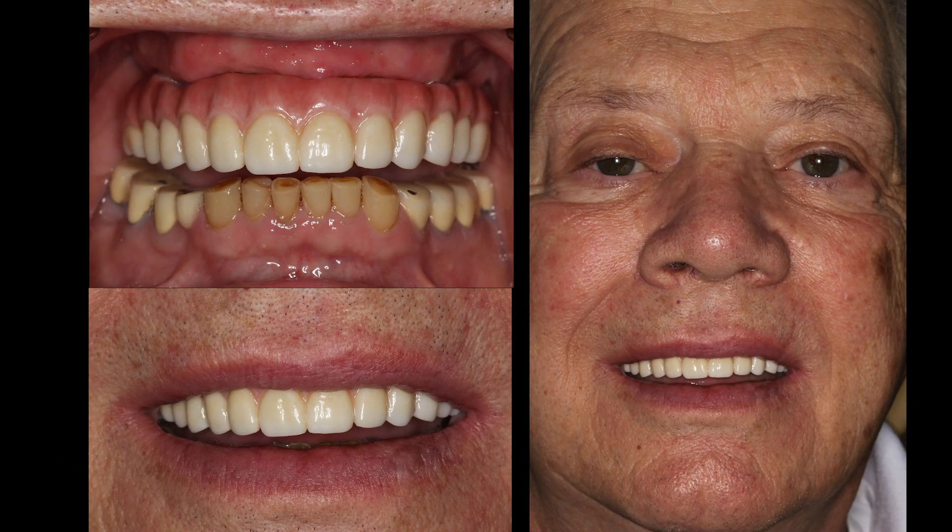In conclusion, for many years the best implant option for the fully edentulous patient has been the fixed acrylic hybrid denture. Although these appliances have served patients well and have been nothing short of life-changing, they have also been subject to wear, chipping, breakage, and debonding of the denture teeth. Recent technological innovations have brought about the Bruxer full-arch implant prosthesis, which pairs the optimal function of the traditional hybrid with the superior strength of monolithic zirconia. As patients respond to the newest and best implant dentistry has to offer, the ability to create restorations that are at once aesthetic and durable is both rewarding to the dental professional and sought after by the public. Thank you.